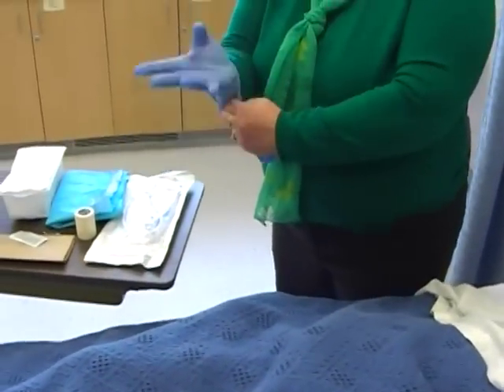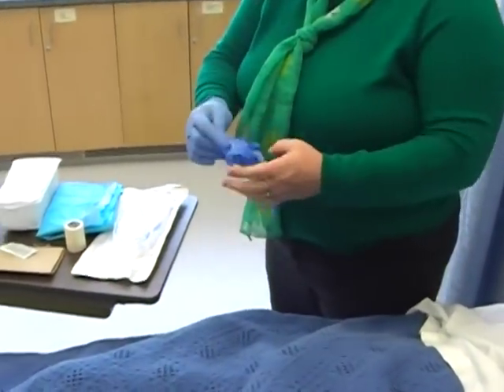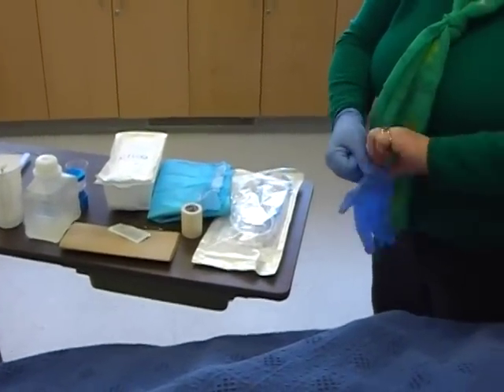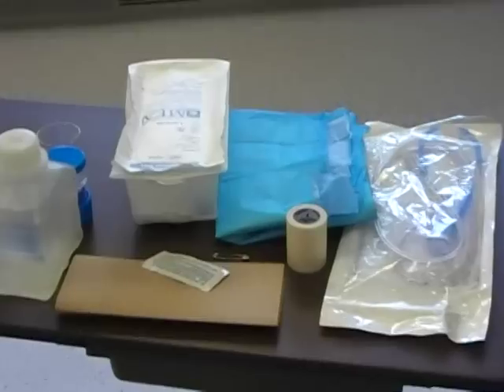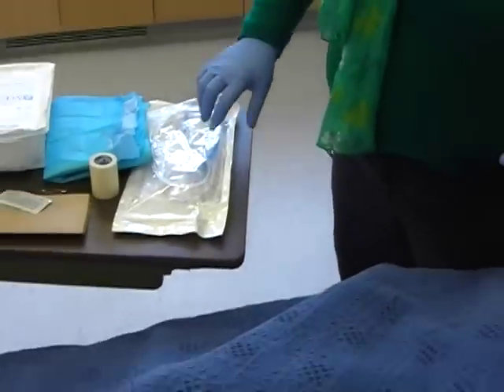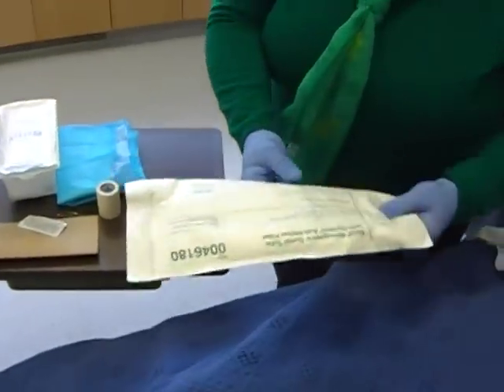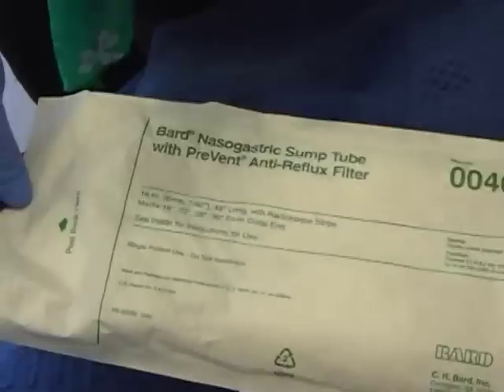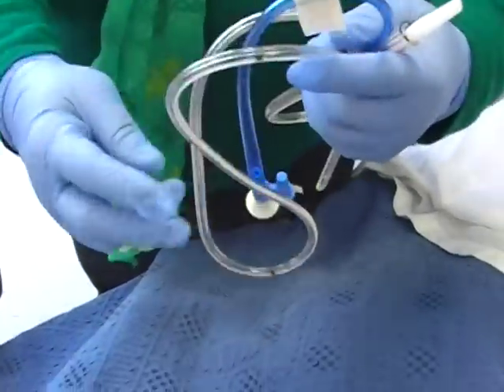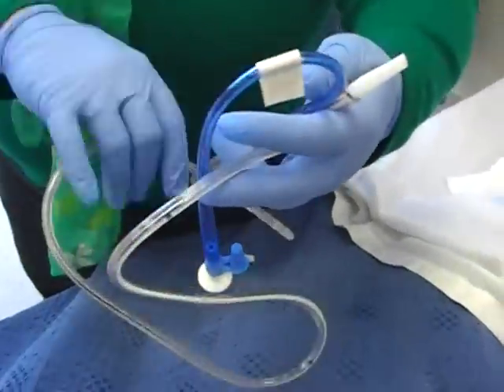This video is about learning how to insert a nasogastric tube, or NG tube, into a patient. We have an order to insert one. Every facility may have different packaging, but the NG tube itself will look the same.